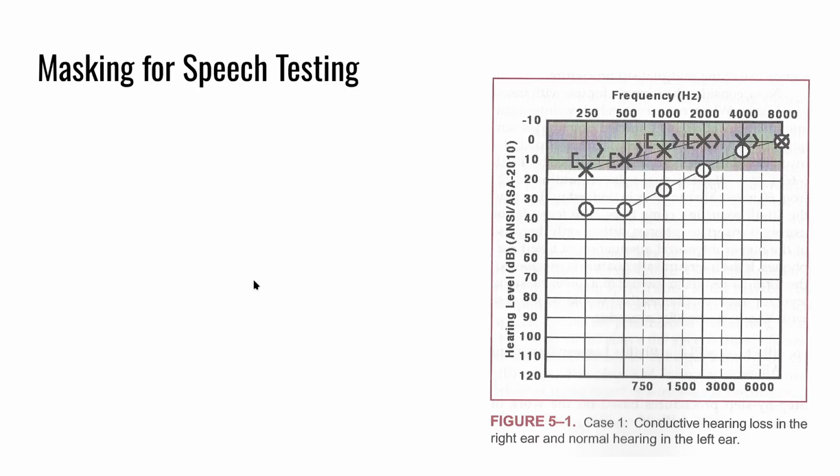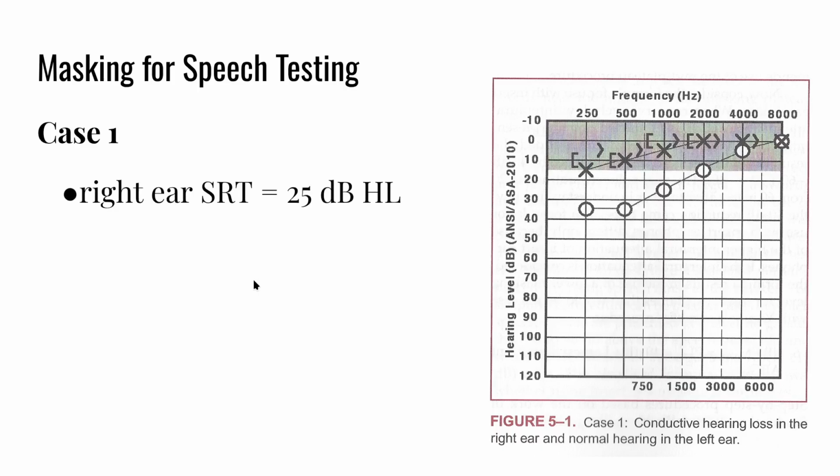Comparison between the right SRT and the best bone conduction threshold does not exceed 40 dB. In this case here, our SRT is 25 dB.